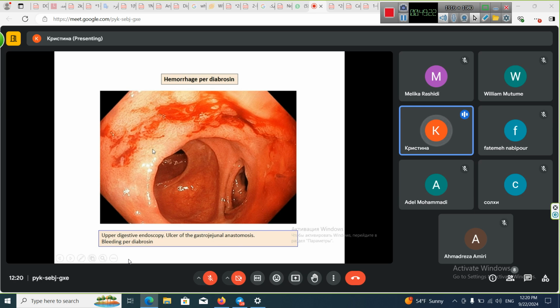For some reason, something bad happened to the mucosa, the inner surface of the stomach, and the acid from the stomach came deeper into the wall of the stomach, and there it caused erosion of blood vessels, and blood goes from the blood vessels, and it can be seen now from the surface of the stomach.